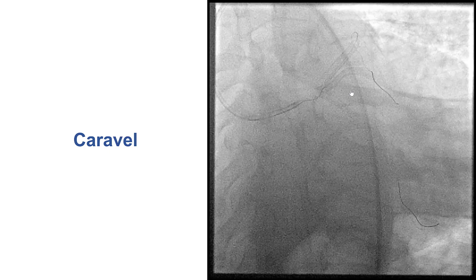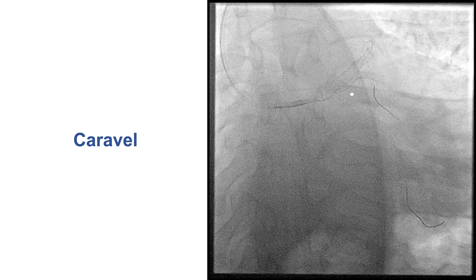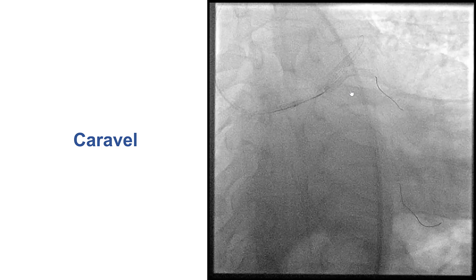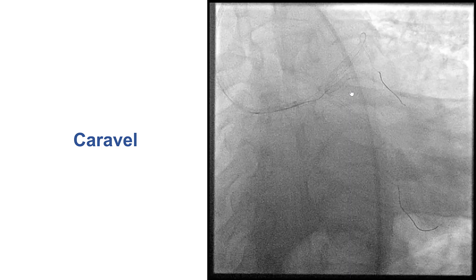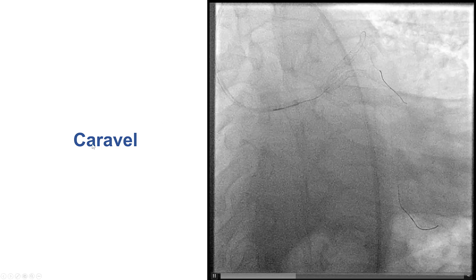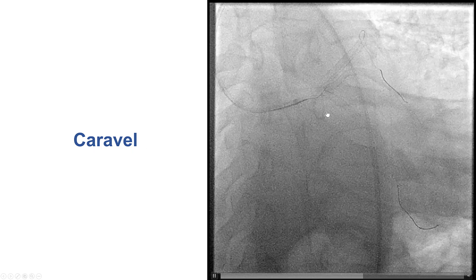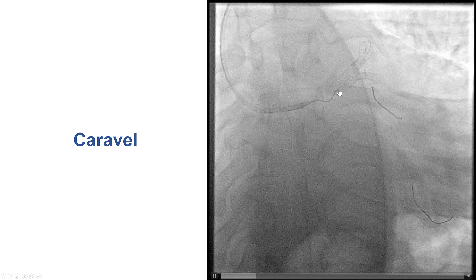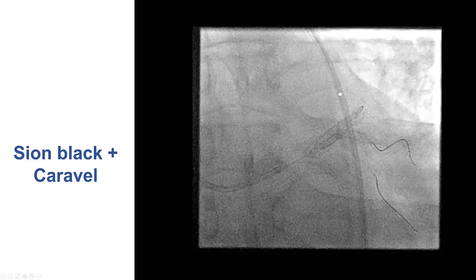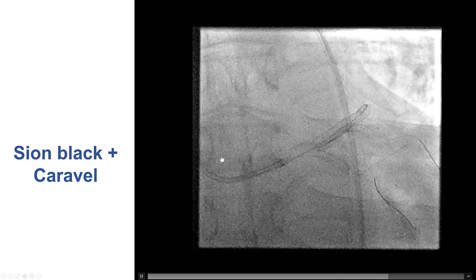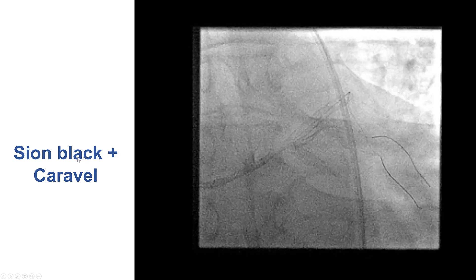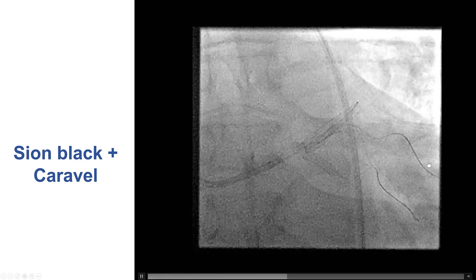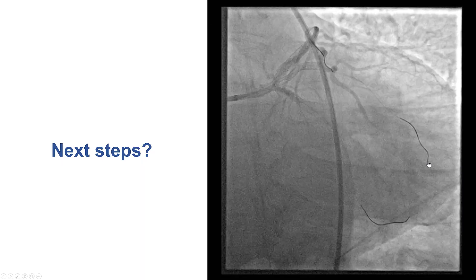There are different ways to approach this, but the two key ways are to change the wire or get a microcatheter for support. We inserted a small microcatheter — a Caravel — close to the origin of the ramus branch and tried to wire again. We still had difficulty, but after using a polymer-jacketed, non-tapered wire, we were able to wire into the ramus branch through the occluded stents.